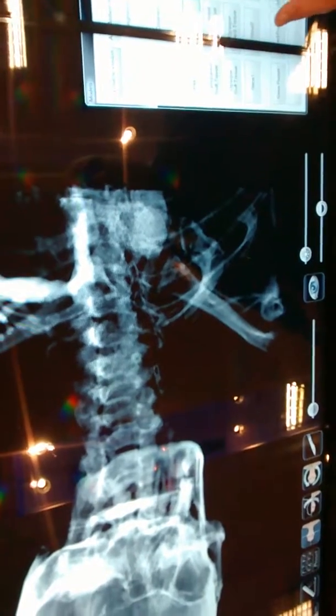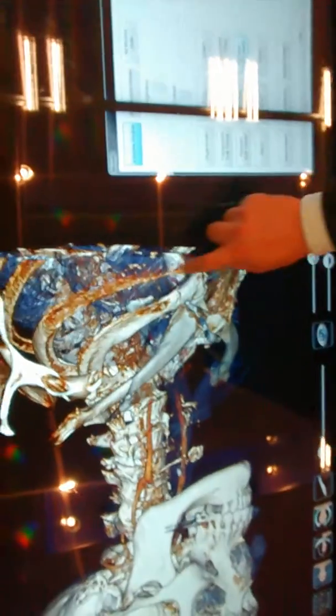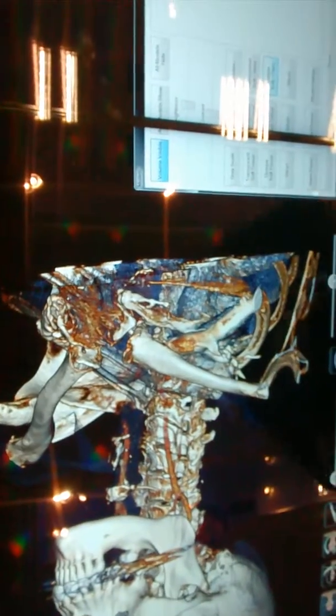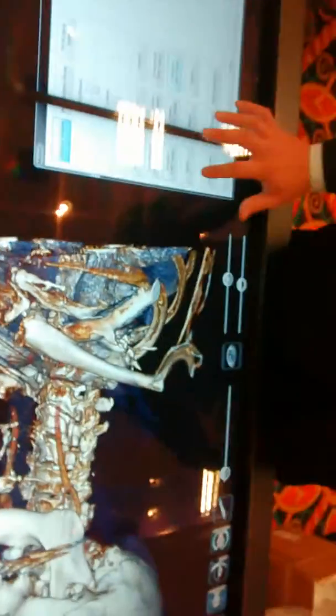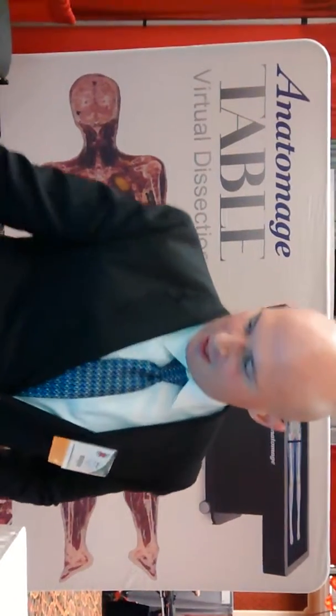Let's say if we wanted to move, here we can see lung tissue along with density. And at any time you have access to the original slice data as well with typical radiological presets here. So it just depends on what you're looking for.